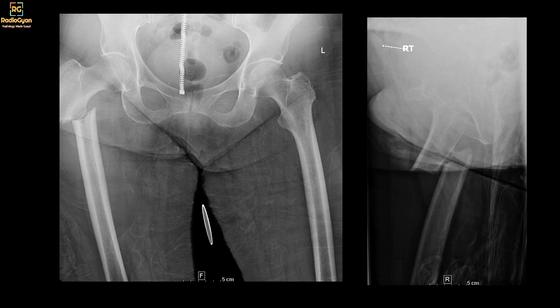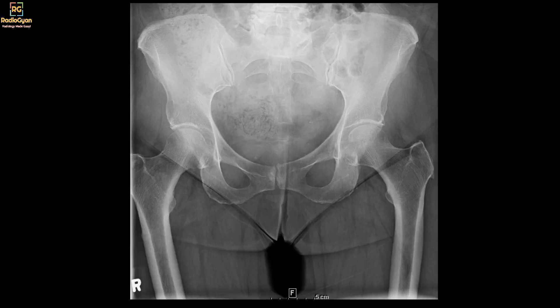What was more interesting is that my staff told me to go and have a look at an even prior radiograph — a radiograph done two years ago — which showed a subtle cortical breach along the lateral aspect. If you see, there is this tiny break at the lateral cortex, and this was two years ago, a year before she had actually fractured.